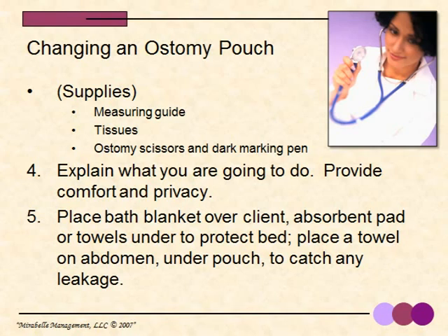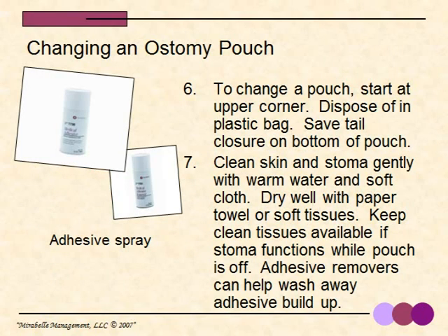Then I like to place a small towel on the abdomen, kind of slide it underneath the pouch to catch any drainage that may occur. To change a pouch, you want to start at an upper corner, and as you remove the old pouch, kind of push against the skin while pulling down on the pouch.